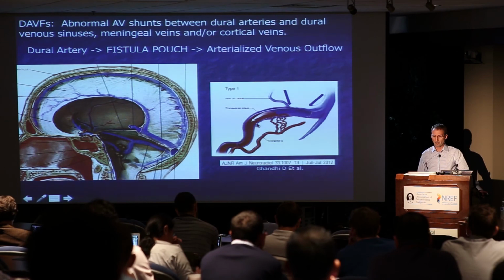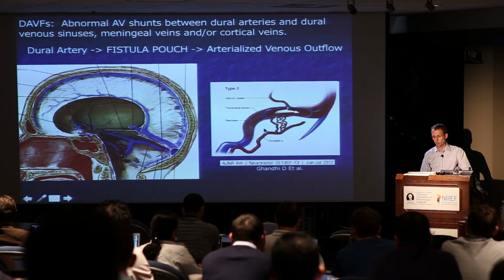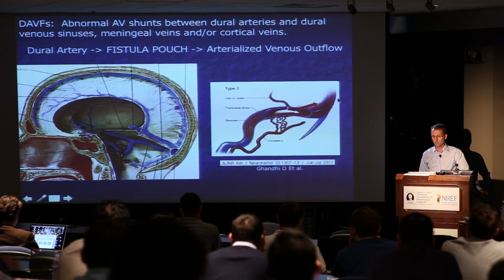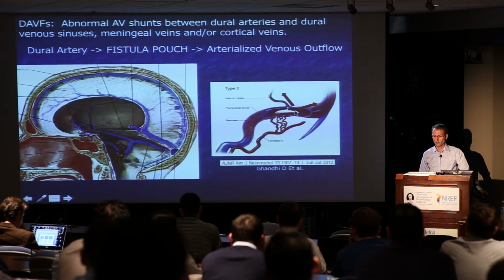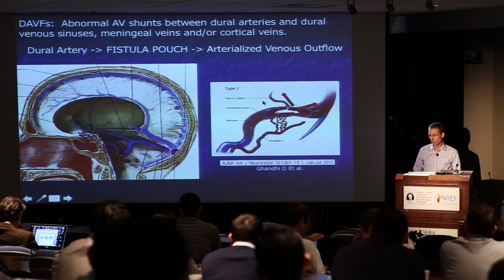They could cause pulsatile tinnitus given their proximity to the inner ear, the temporal bone, if you will, but they're very low-risk lesions. Well, consider an alternative where the outflow of the sigmoid sinus to the IJ becomes, say, sclerosed and occludes off. Well, now the arterialized portion of the sinus has to direct its blood elsewhere. In this case, now it's going to be retrograde, say, in the sinus. Perhaps most concerning would be retrograde arterialized blood in a cortical vein, so here the vein of Labbé.